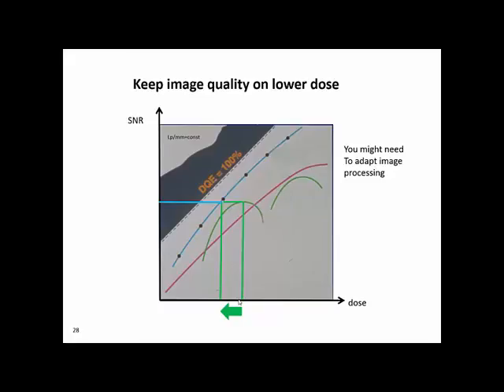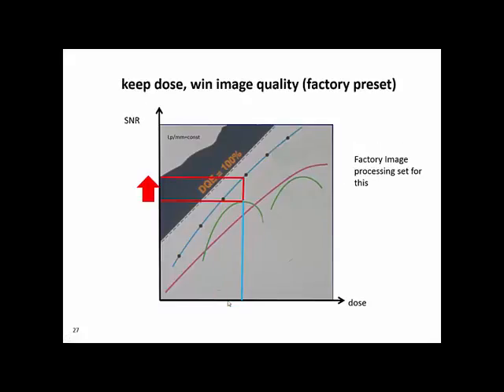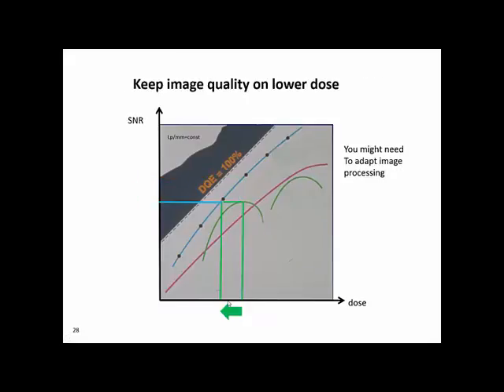What we see here is that we are not supplying a better image quality compared to a film now. The image quality in terms of signal to noise is the same, but on a much lower dose level. So we could say these two points are two distinct points that are quite typical, and we could adapt to that. Our service, our application will do that.